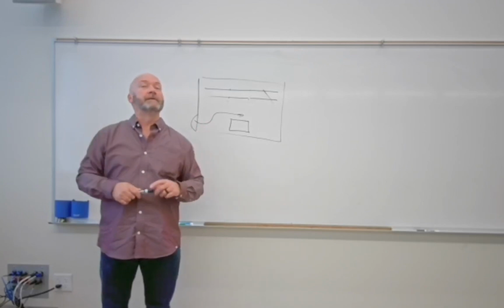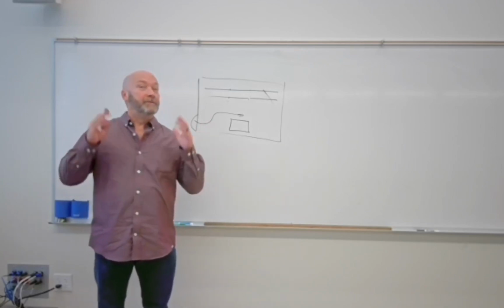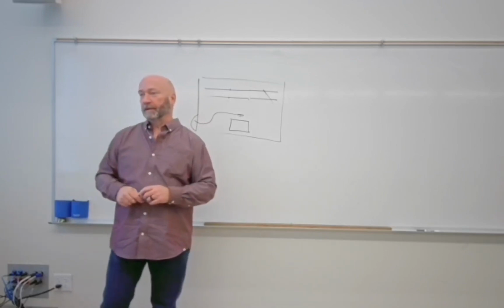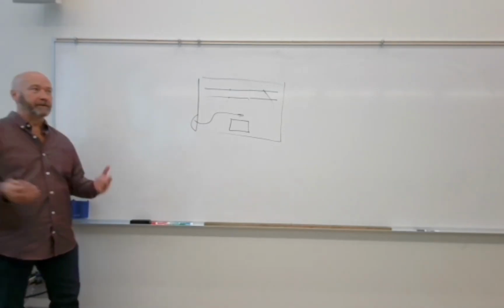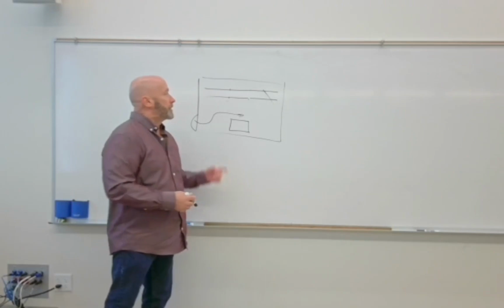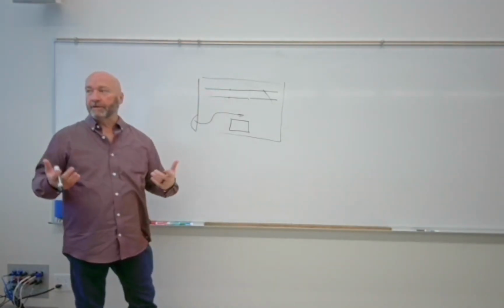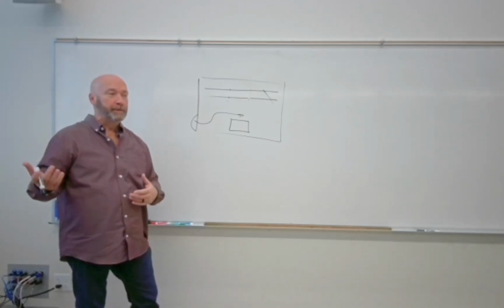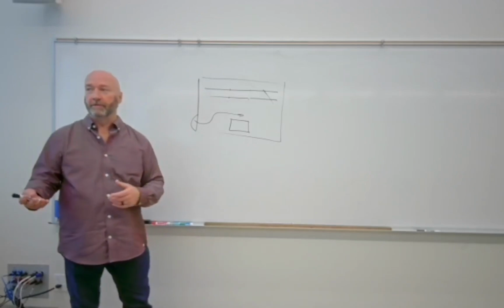We could change that, but it's going to take us about 2 months and another $250,000. So that's the reason our room was set up completely backwards, is because administration was not going to have any part of delaying the construction of the building for that length of time. But all of that goes into supporting this, because the X-ray tube is heavy. Well, the tube itself is not heavy, but all the stuff that goes into the tube is heavy, and you don't want it to fall on the patient, right?